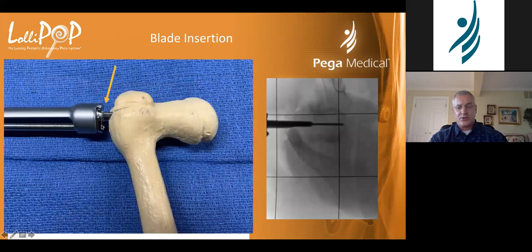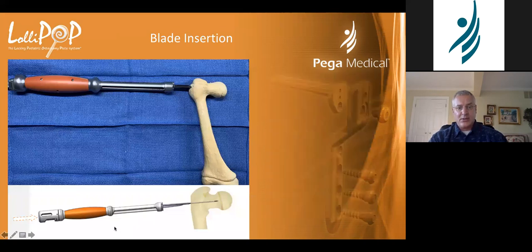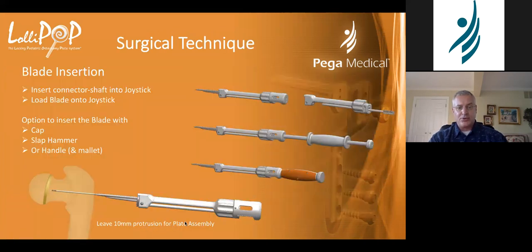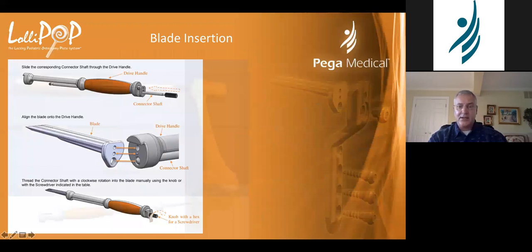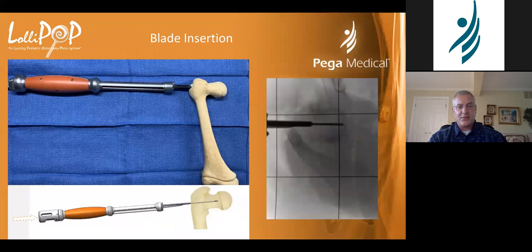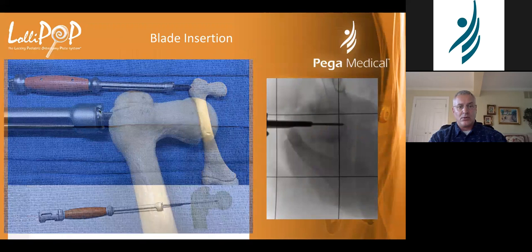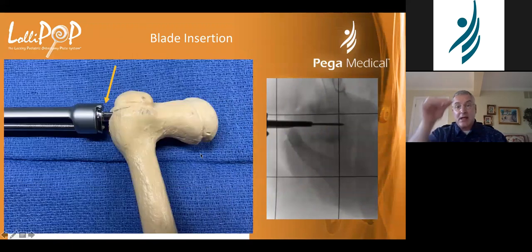And you always want to, and I think it was previously stated and I jumped over it, leave 5 to 10 millimeters of protrusion of the plate assembly. It's going to be very important when you connect your blade plate. So you can see that I'm driving the blade in, and I leave just a little bit. That's probably about 6-7 millimeters out. You want enough of this little Batman sign, or little stop sign we call it, to be able to engage onto the plate.